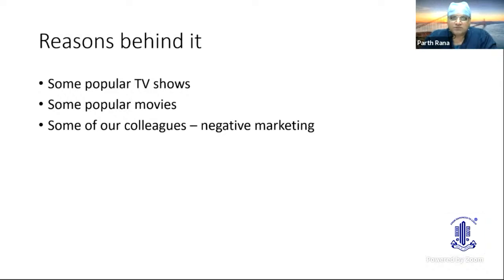As I told before, so many of our colleagues were avoiding doing fundoscopy when they wanted to do LASIK on the same day. Now they are sending the patients because they know we don't have to dilate to see the periphery. So this is changing habits, not only of retina surgeons, but of general ophthalmologists also. And it's going to change the practice pattern. Right now, when a patient comes to me, all of the patients have already done Optos, and then they are coming to me.